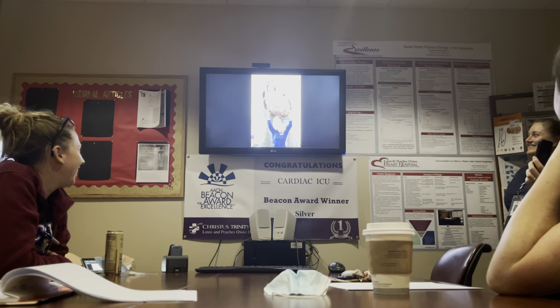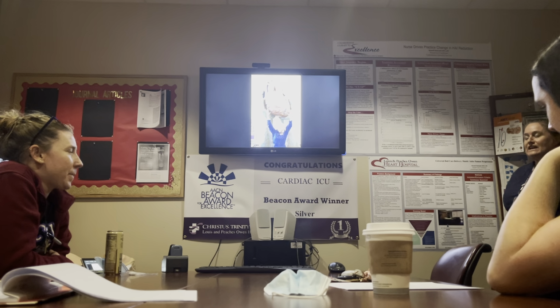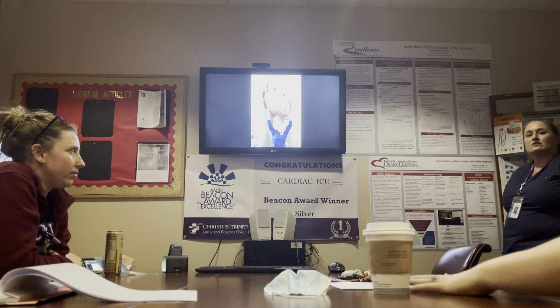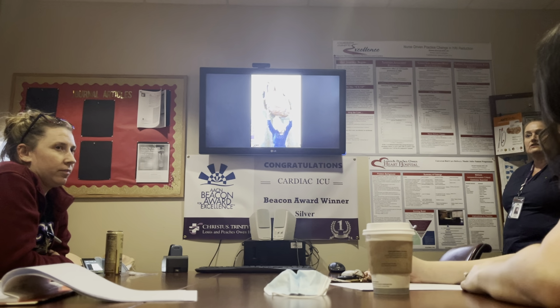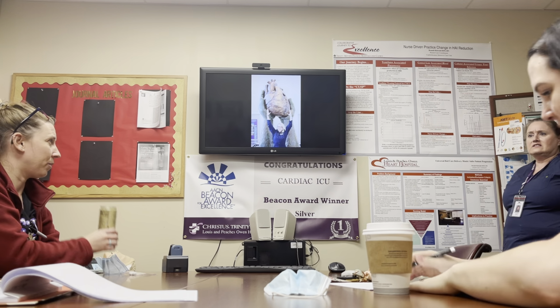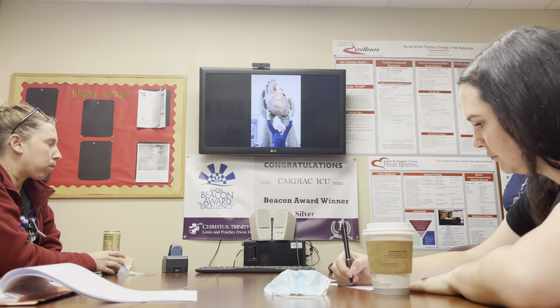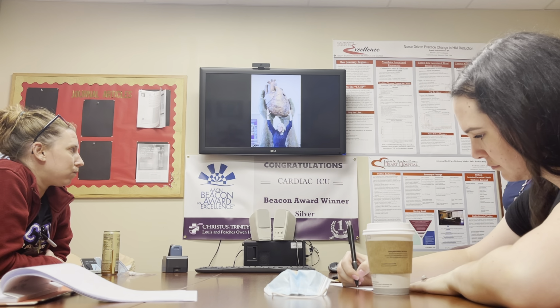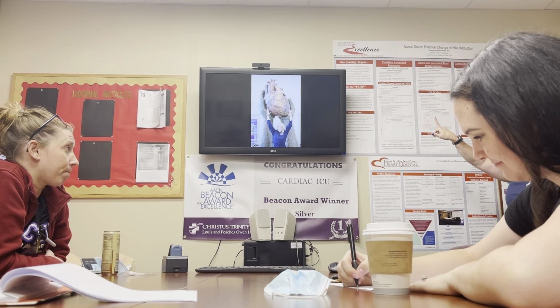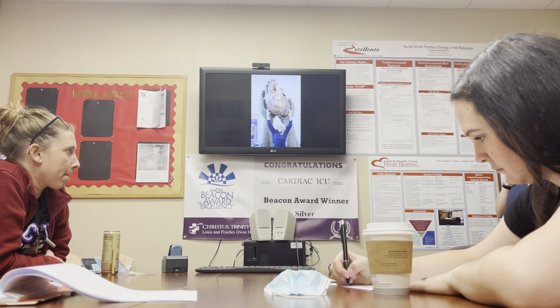Does that come with time, just being able to find the little details? I'm not expecting you guys to be experts, but I want you to be able to look at the things that you need to look at. How many times do you guys call me and say, is the feeding tube okay? Can we use the feeding tube? Is the central line okay? If the central line is going towards the heart, that's great. If it's going up towards the neck, then we need to reposition it. So those are the types of things that I want you to be able to recognize.